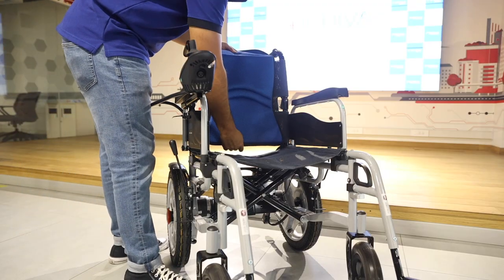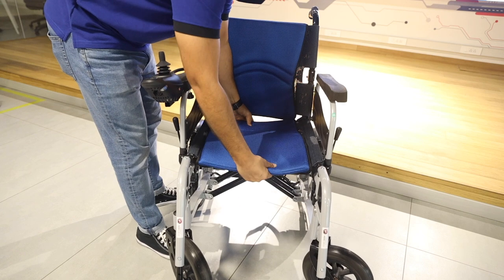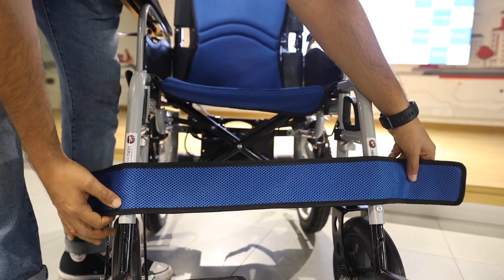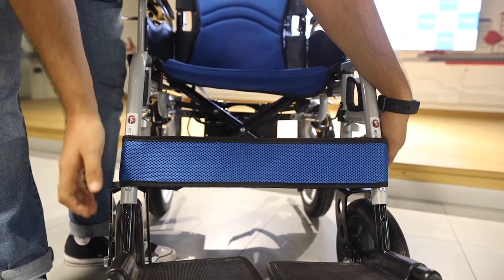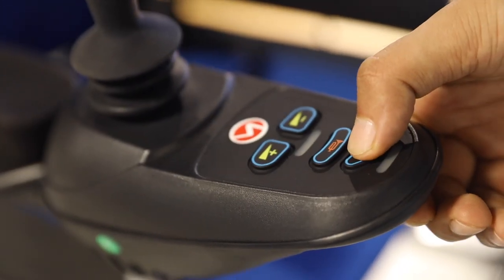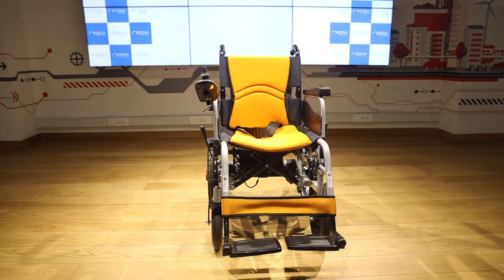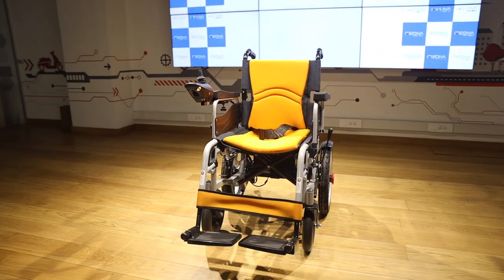Attach the backrest, the seat, and the calf strap. You're now ready to operate your electric wheelchair. The MHL 1007 is now ready to go.